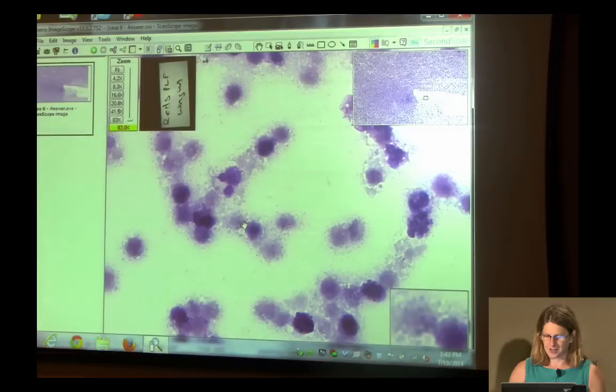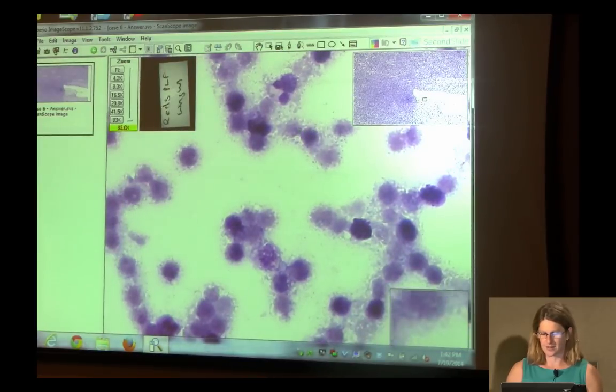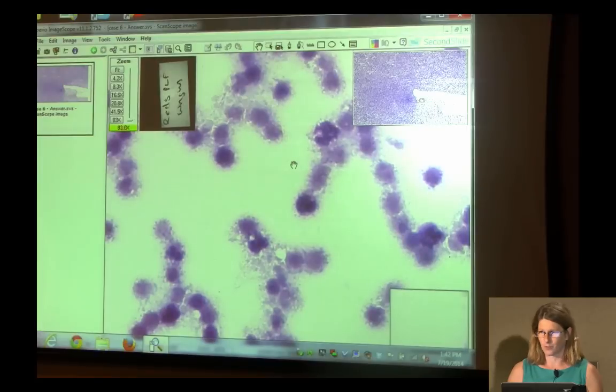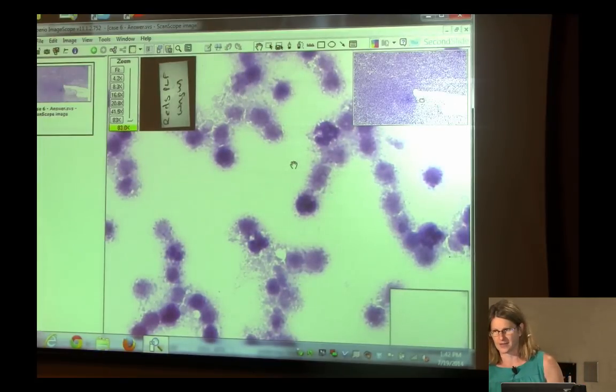So these are ruptured, lysed neutrophils. These are dying, dead neutrophils. And this cat had like a 400,000 nucleated cell count in its pleural fluid, which is never a good thing. It looked like pus, and that's exactly what it is. So you're looking at this, you're going to go, I have no idea what these cells are, and neither do I. And I have two choices.